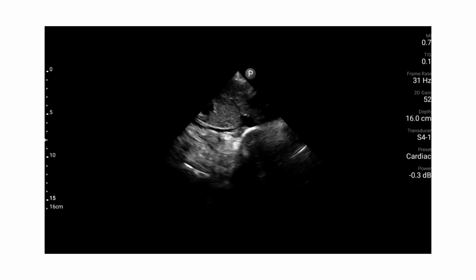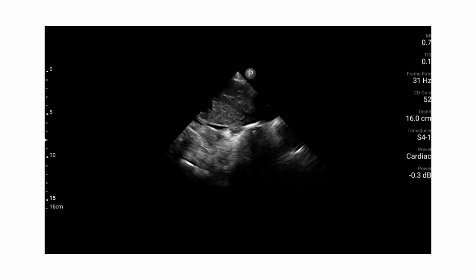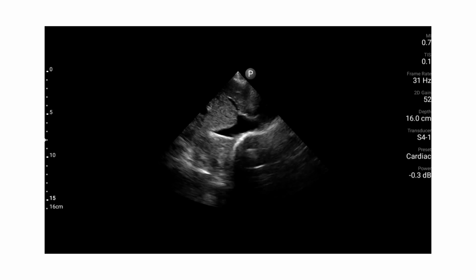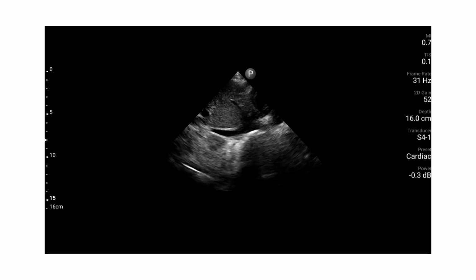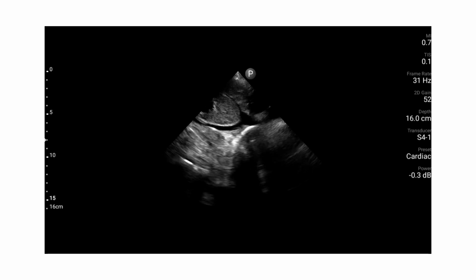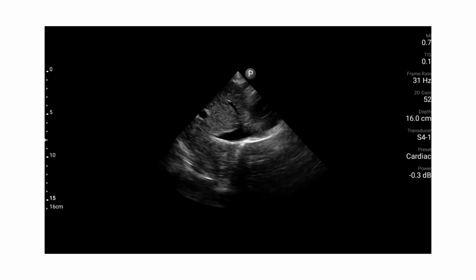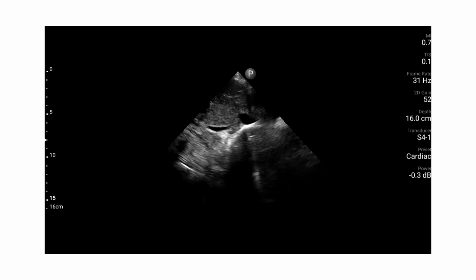On cardiac assessment, this patient also had hyperdynamic wall motion, and so that keyed us in that that's a clue that the patient would be fluid tolerant. Patient received fluid bolus and improved considerably. In this particular case, a patient that had pre-existing heart failure as well. So that's where it can help to guide our resuscitation a little bit.